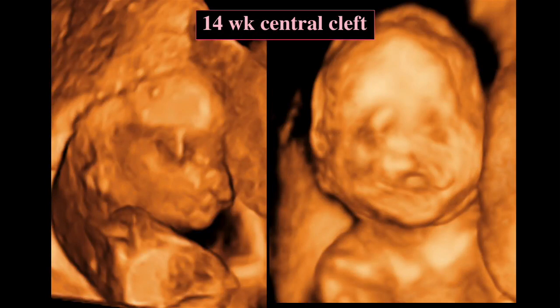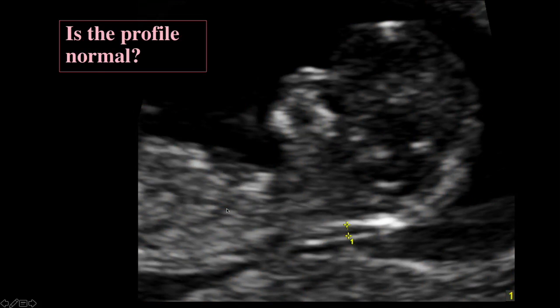And here's an example of the central cleft. This is a 14-week fetus, where you can see here there's hypertelorism. In this case, the nose is really non-existent, it's flattened, and there's a big central cleft right in the center right here. Now, this was a nuchal translucency brought to me by one of my younger sonographers. And anybody see any problem here? It's a cleft. There's an abnormality here, which catches your eye when you start looking at the nasal bone.